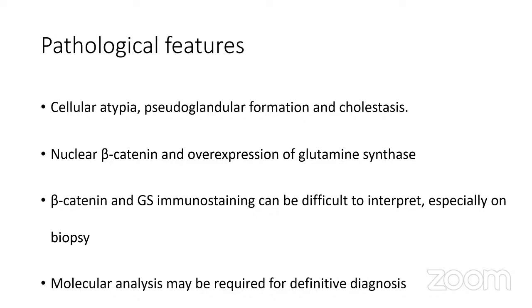Both these stains can be difficult to interpret on needle core biopsies, and sometimes they are less diffuse than the usual examples, and if they are less diffuse, then molecular analysis may be required for definitive diagnosis.